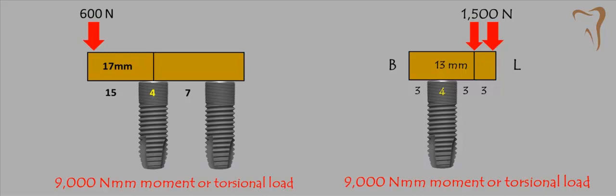But you look at this and you say, okay, at the top we have patients are totally different. She can chew like a gorilla, and she has a gorilla bite, and you have more torsional loading, and there's a reason that implant broke.